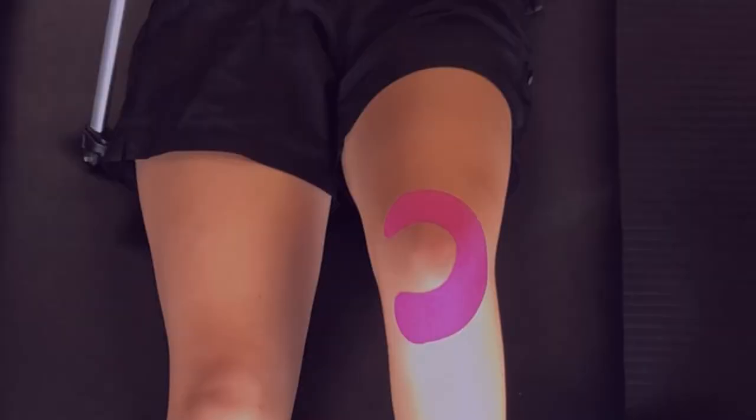Today we're going to be looking at two methods to tape your patella to reduce kneecap pain during activity. Patellofemoral pain is a complicated injury and there's numerous variables which you'll need to address in order to fully resolve the symptoms. The taping techniques that we're going to show you today are simple ways to reduce your symptoms so you can continue training.